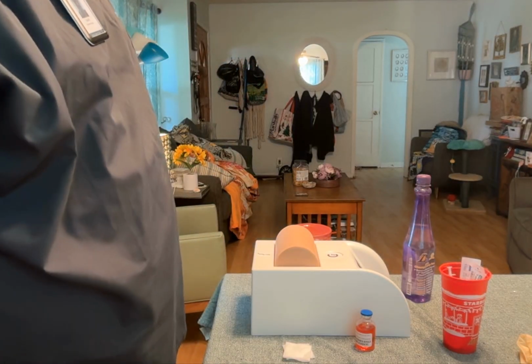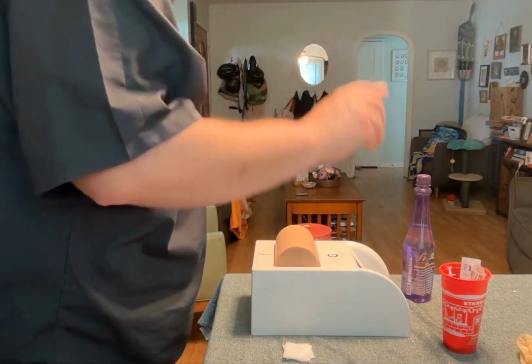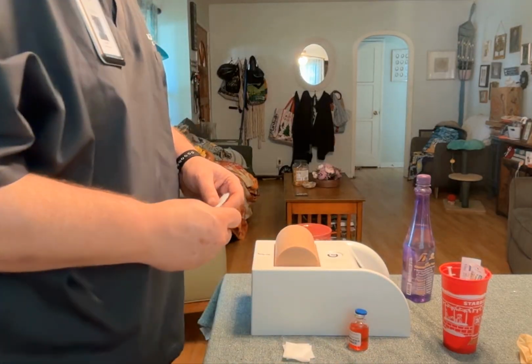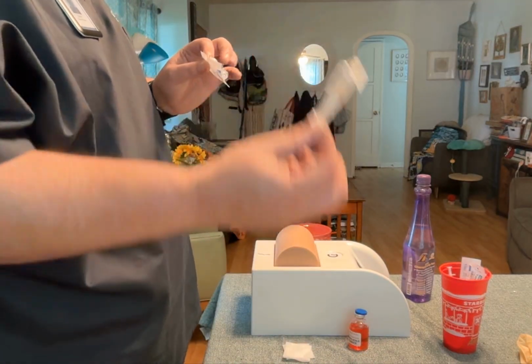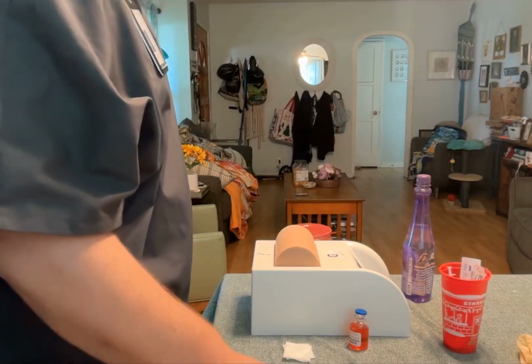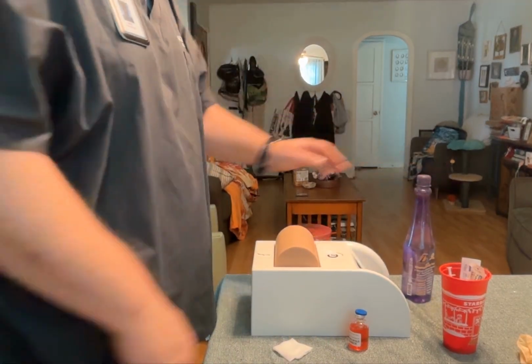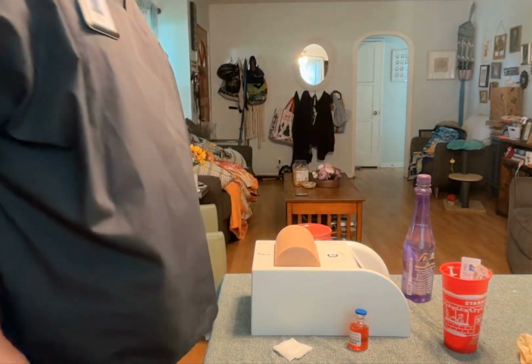I first come into my med room and I gather my items. I have morphine sulfate, the medication. I have alcohol pads. I have my 1 to 1.5 inch needle. And I have my Terumo syringe, 3 cubic centimeters. I have gauze pads. I have hand sanitizer. I have my sharps container, and I have gloves ready to go.